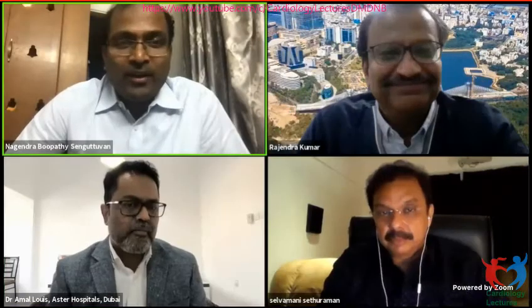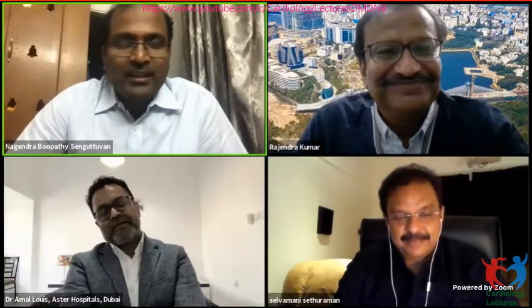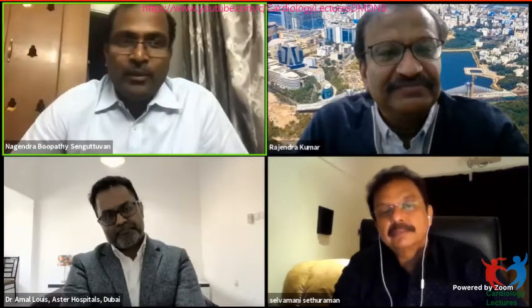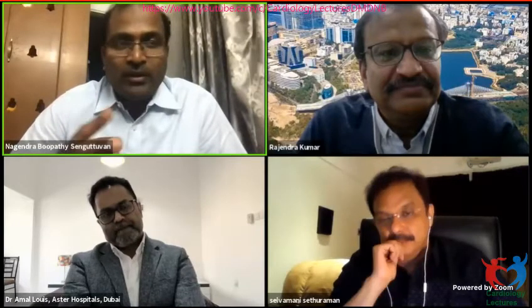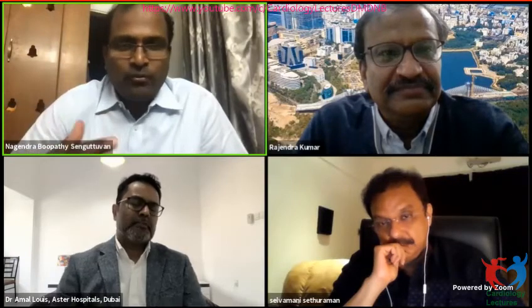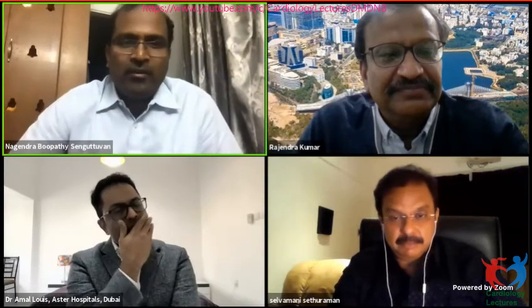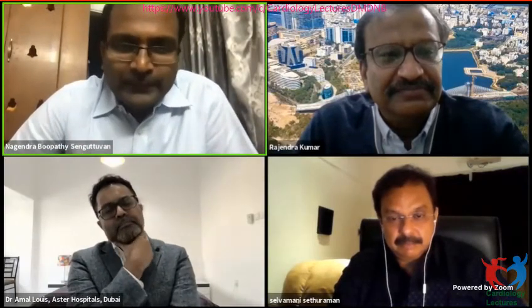I don't think they have made the system in such a way that it can be reused. If a small amount of clot is identified in it, I think it will give a signal so that it cannot be reused. All these cases were not done in India. A couple of cases were done over 6 years, the last case in 2013, 4 years ago, in 2014. But none of the cases were done by me in India. I was a fellow there when we were helping with those cases.